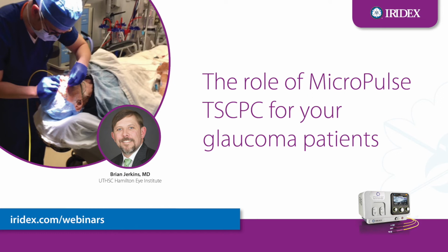That is really one of my favorite questions to get, even from patients. I don't normally feel like I see the effect for several days, really up to more like a week to 2 weeks in my experience with it. And that's why I don't see a patient back on day one. I don't feel at day one I'm going to be seeing any results, and just don't make the patient come back. So really around 1 to 2 weeks is when I tend to see the biggest drop.